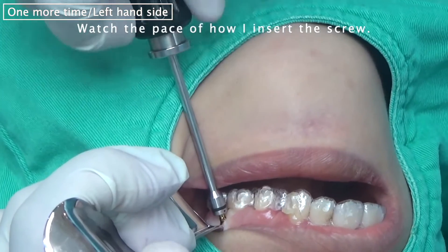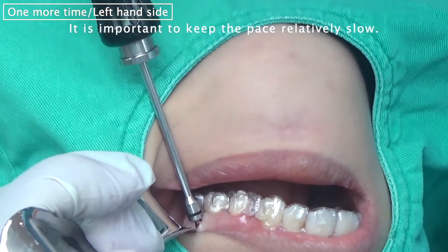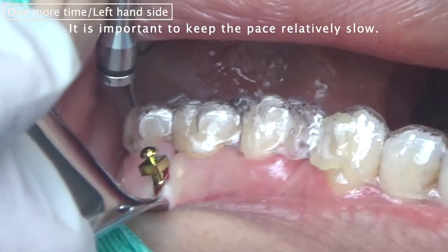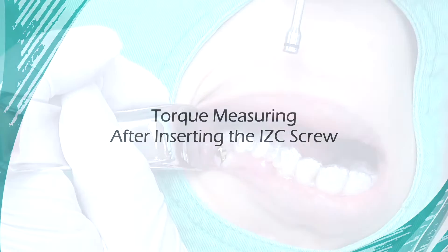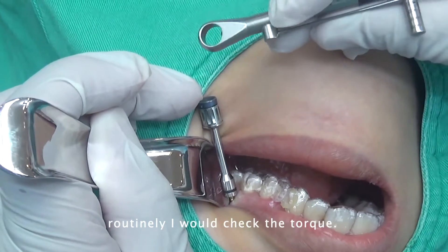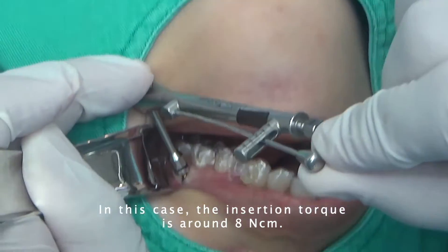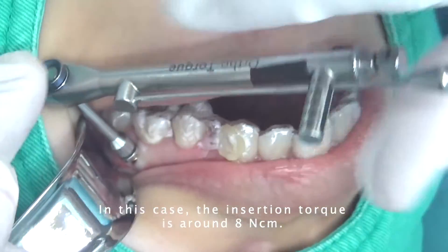Watch the pace of how I put the screw — it is important to keep the pace relatively slow. Every screw that I put in, I would routinely check the torque. In this case, the insertion torque is around 8 Newton-centimeters.